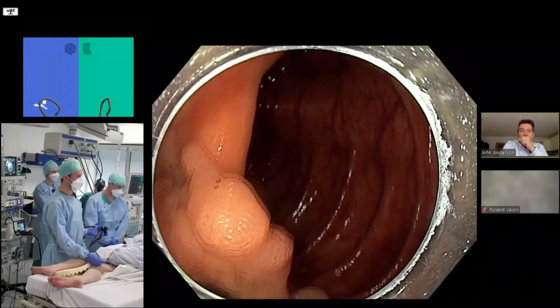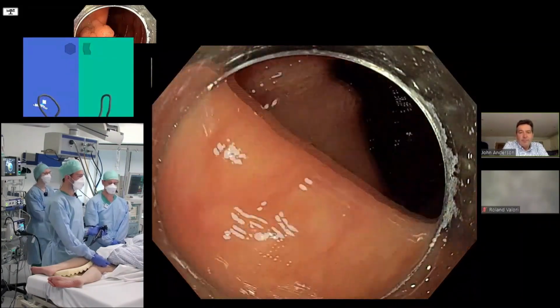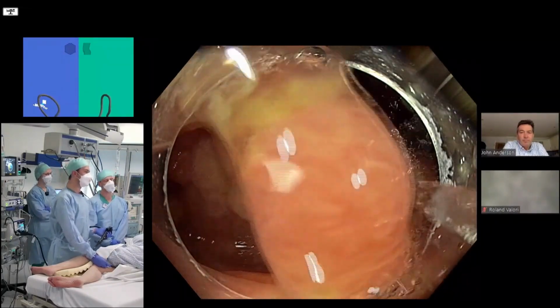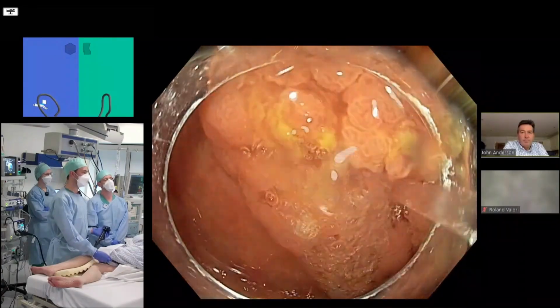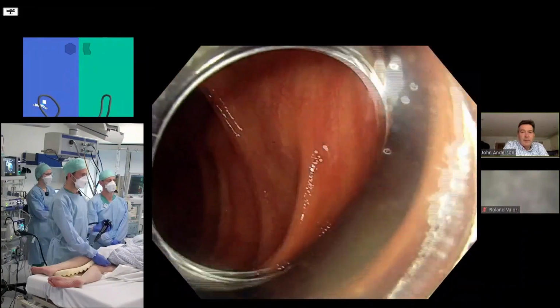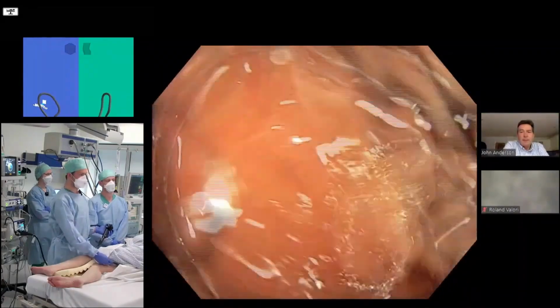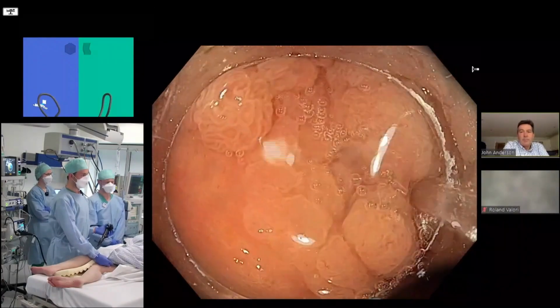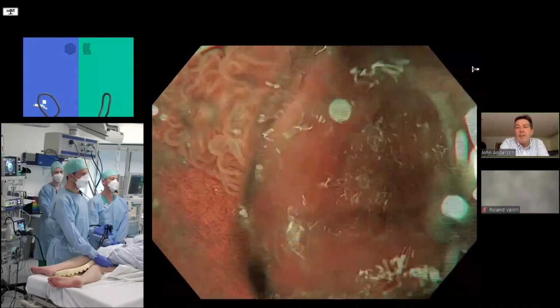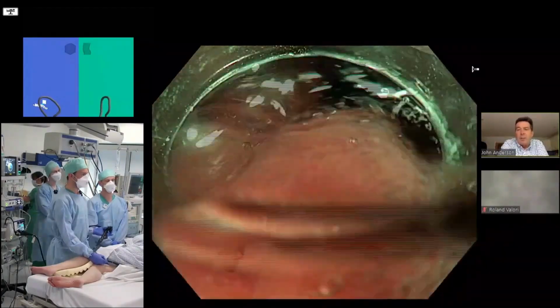So at one edge of that, you were just washing some mucus off there, David, just at the anal end of it. Are you concerned about it? Well, no, if you come slightly further back, I just thought, how often do you see any sessile serrated tissue adjacent to a lesion like this, or is it never? This is not a sessile serrated. No, I appreciate that. Anyway, it looks clear with washings. So the 2 things that give you mucus are the SSLs, but a villous component to the adenoma could pump out lots of mucus. So this will have a villous component to it.